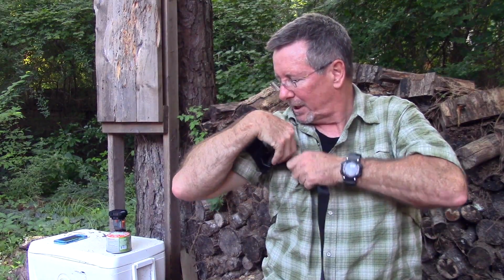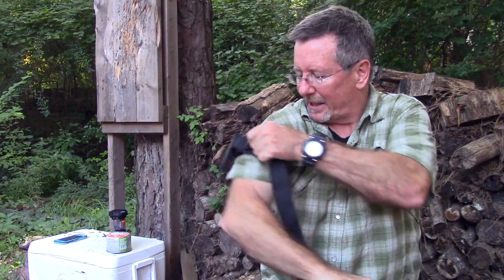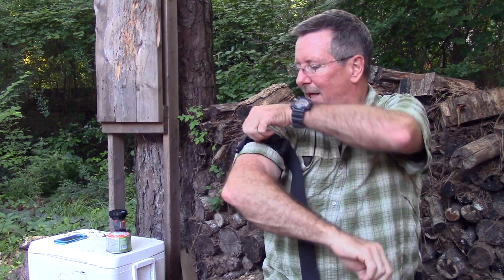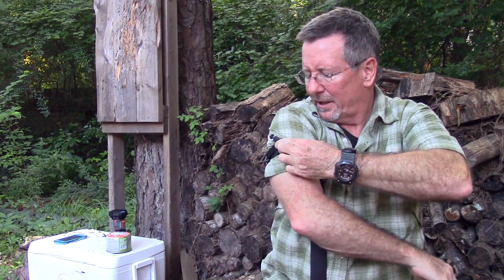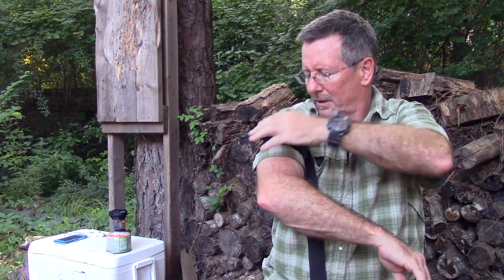Still kind of hard. It's really hard for me to get this one tight enough one-handed, to be honest with you, because it's pretty loose there. I think you need to get it tighter to start, so you can kind of clench it down and pull it. Once you get it tight, then you can wind it up pretty good, and I can tell that's definitely getting tight. A couple more turns, it would definitely be working.